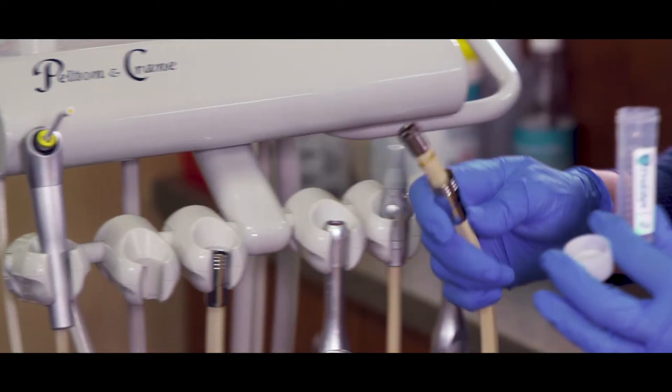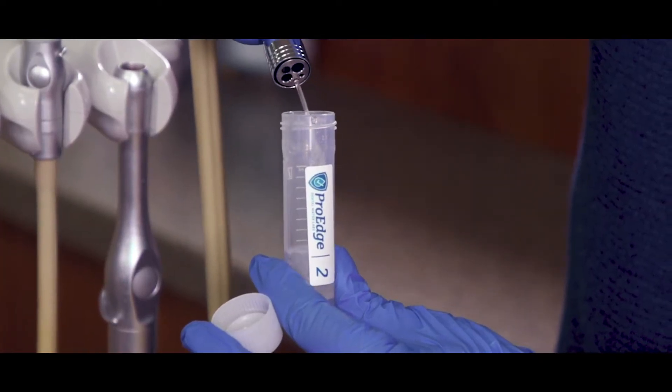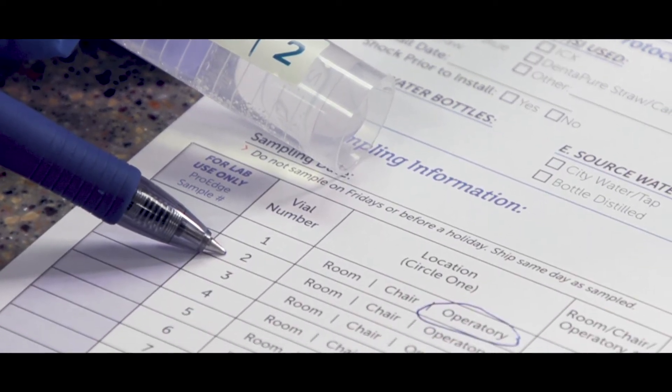Next, sample a handpiece line in the same operatory. For vial number 2, follow the same process — match vial 2 with the correct row and complete the information.